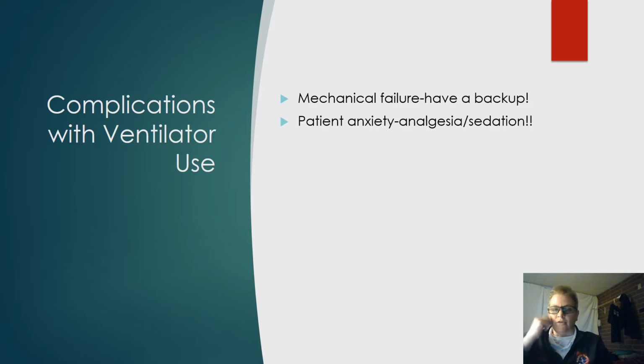Patient anxiety. So using analgesia and sedation. I'm going to harp on this over and over again, but just imagine yourself being intubated. You have this big tube between your vocal cords. You're not in control. Something else is initiating your breathing. You wake up enough and feel that pain enough. What are you going to do? You're going to start fighting that tube. You're going to start biting down. You're going to start breathing out when you're supposed to be breathing in, and having a lot of anxiety.